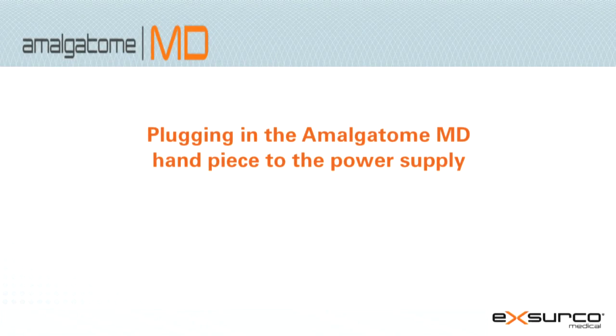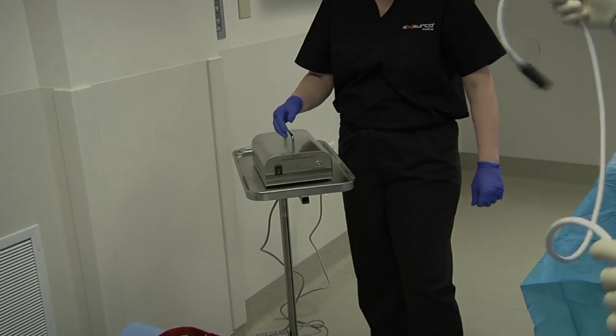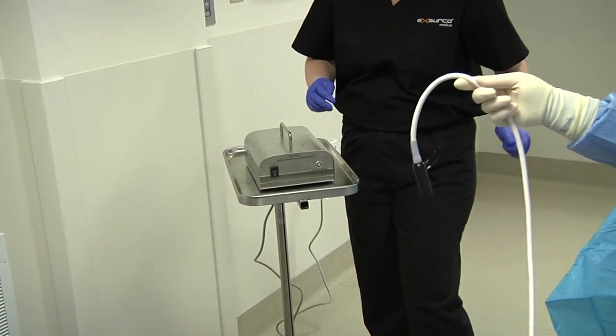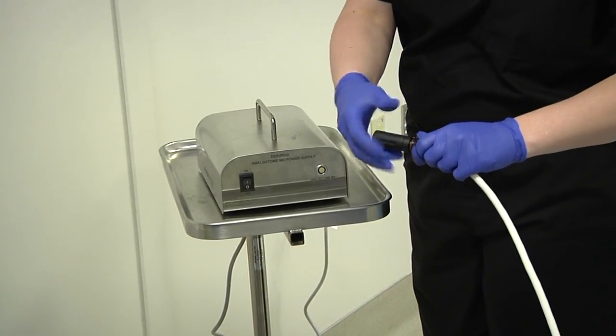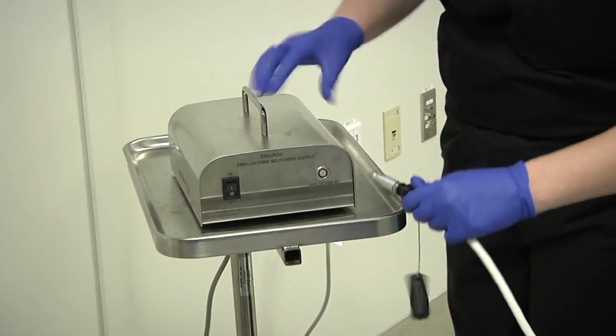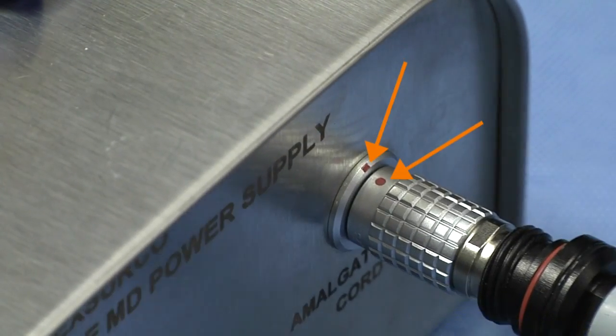Plugging in the Amalgatome handpiece to the power supply. The sterile operator passes the protective end cap from the handpiece cord off of the sterile field. Remove the protective cap from the end of the handpiece power cord. Plug it into the power supply by aligning the red dots.